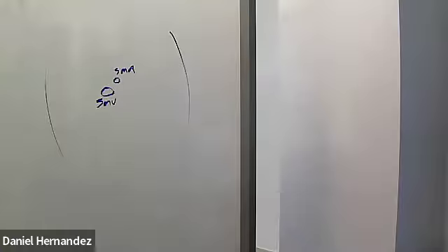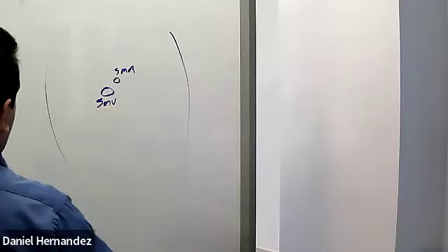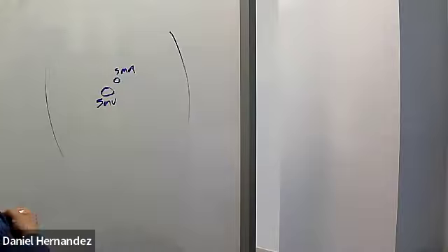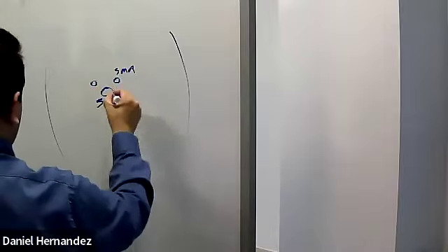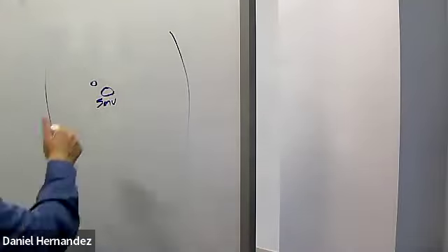With midgut volvulus or malrotation of the gut, the intestines are actually twisted and it causes that orientation to reverse. So instead of the SMA being to the left of the SMV, the SMA is over on the right now. So you can see it over there now.